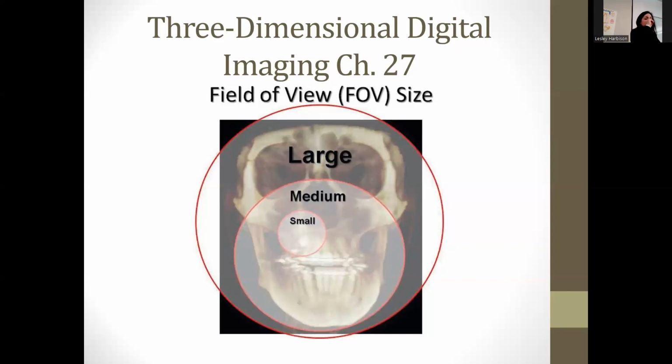Endodontics too, yeah, to see that, because basically what you're able to do is see these structures in three dimensions, so you can see where the canals are going to go, or how much bone is on the facial or the lingual of a ridge, so that it helps with placement of implants and all these different things. I was also noticing that chapter 26 discusses other types of extraoral images, such as the transcranial or specialty images of the TMJ.